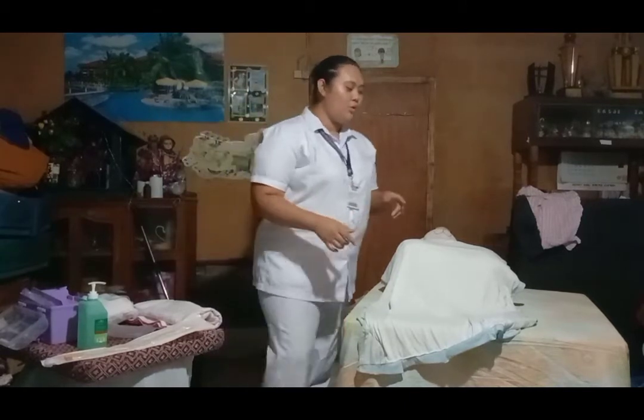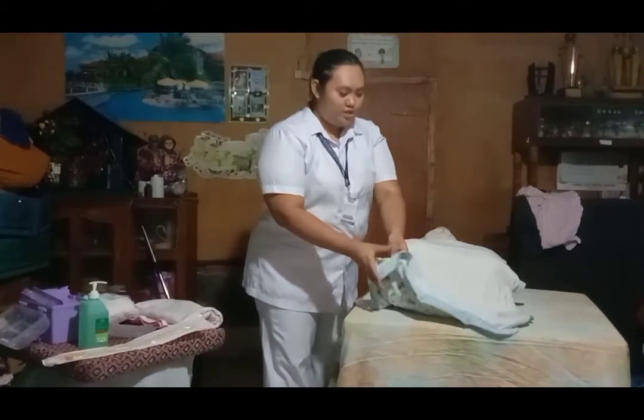Drape the patient, exposing only the area to be used. This is to avoid the patient from getting embarrassed and having chills that can cause tension, which may interfere with the easy insertion of the catheter. So, ma'am, I'm going to expose your genital area.